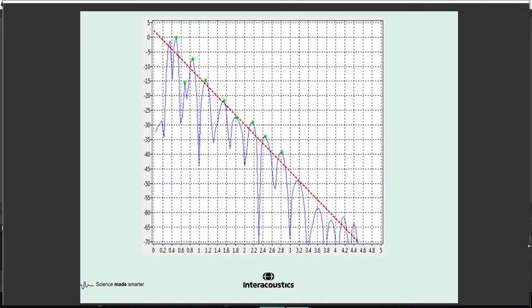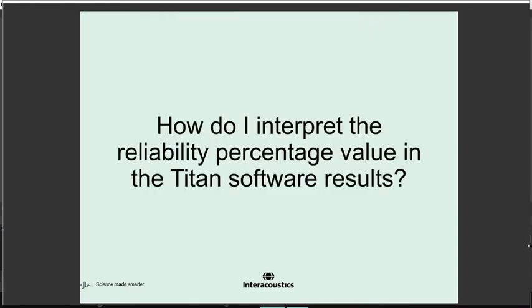And with that, we can predict when the stimulus is at an intensity that is less than we expect the OAE to be. And you can see there that it's going to be at about 4 milliseconds that all of the stimulus has disappeared, or sufficient of it has disappeared that it's not significant anymore with the OAE. And that's all happening behind the scenes, and that'll just give you a green light. Yes, you're good to go. You can start the measurement.